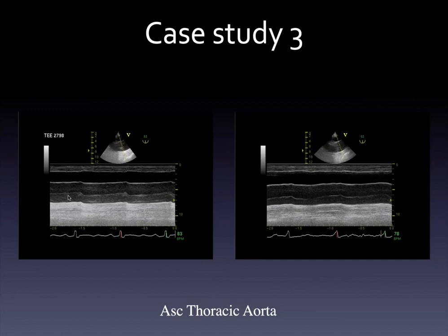You see that this linear artifact in the middle of the aorta, whenever there's a bump up there, there's a bump up here, and similarly, right? So it actually has exactly the same configuration. So what do you think that is? What am I trying to prove here?